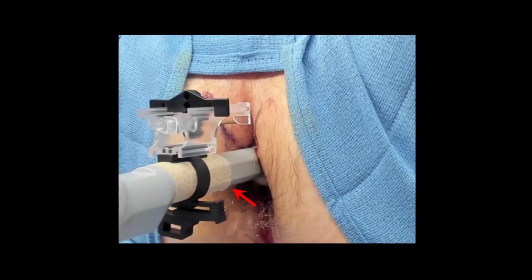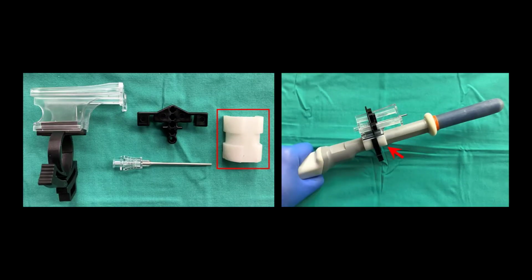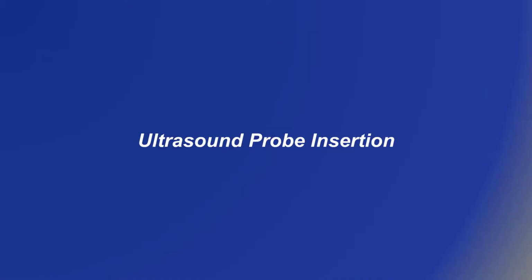To prevent rotation of the device on the ultrasound probe, a piece of Coban wrap may be first applied to the neck of the probe. Alternatively, a custom-made 3D printed adapter may be used for this purpose at the discretion of the physician.